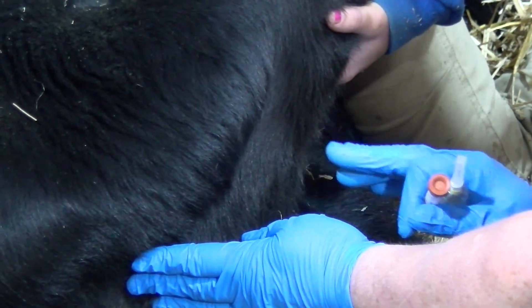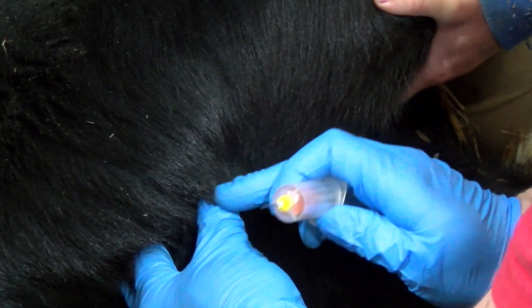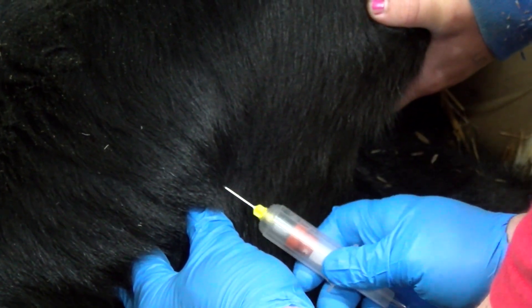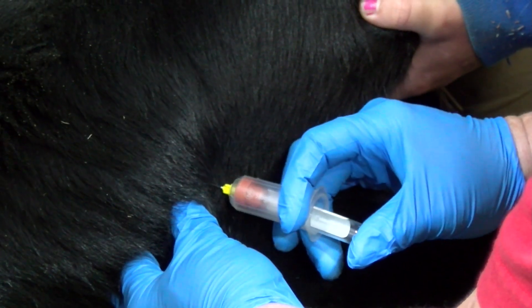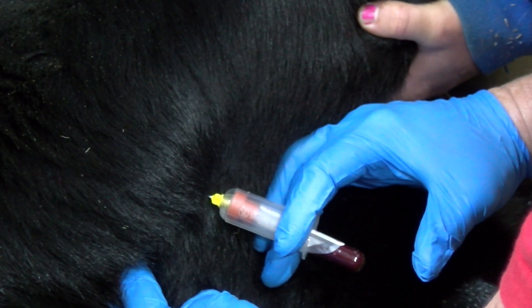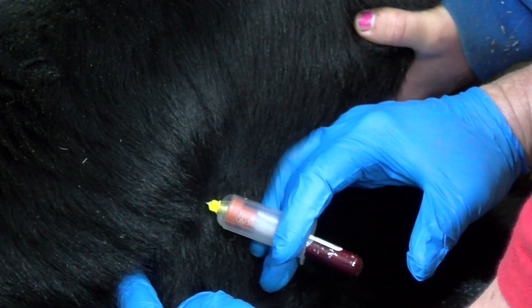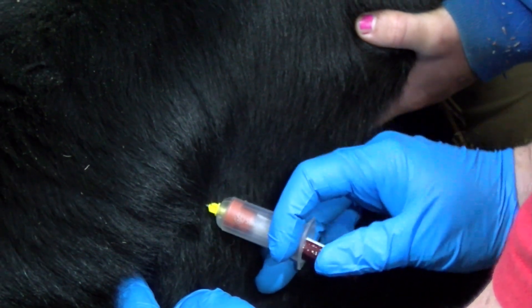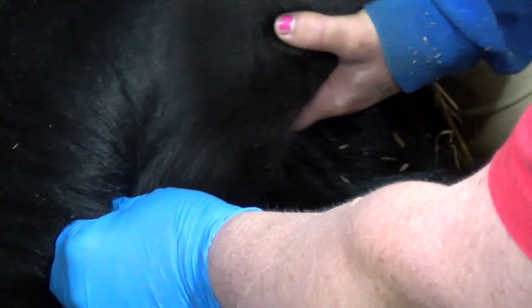When pressure on the vein is released by the left hand, the vein collapses. Once you have found the vein, insert the needle at a 45 degree angle. If a blood collection tube is used, the blood will be drawn into the tube once the needle is in the vein. It is important to note that if the needle is removed from the vein while the blood collection tube is attached, you will lose the vacuum in the tube and will not be able to use it to draw blood any longer.